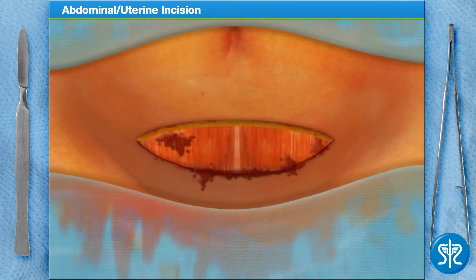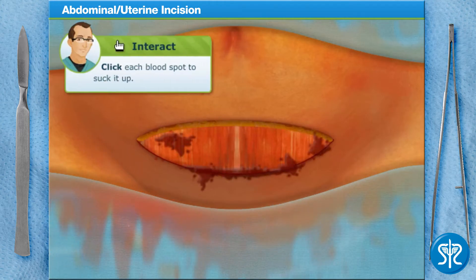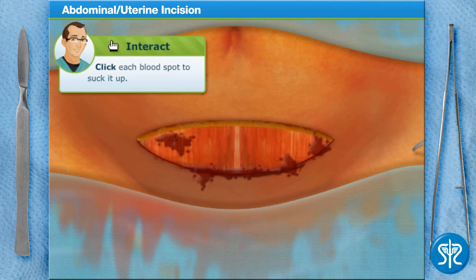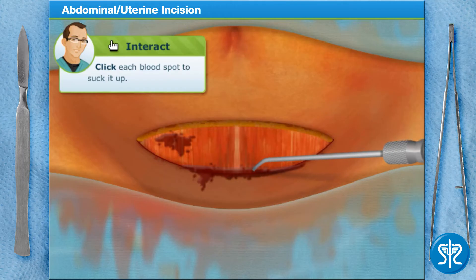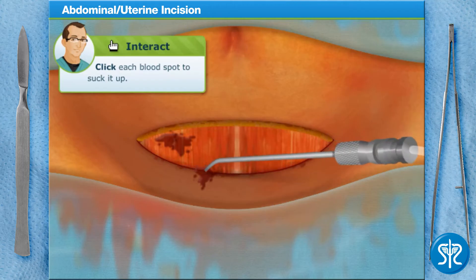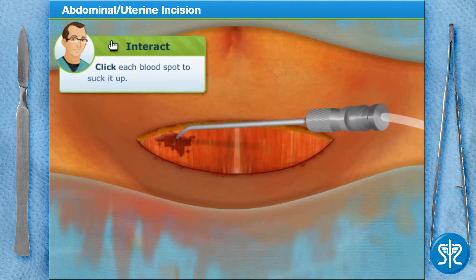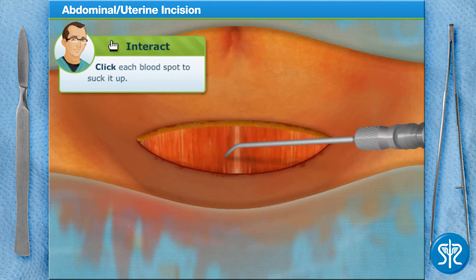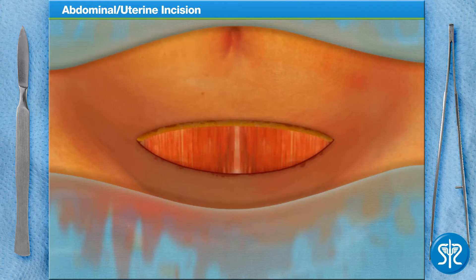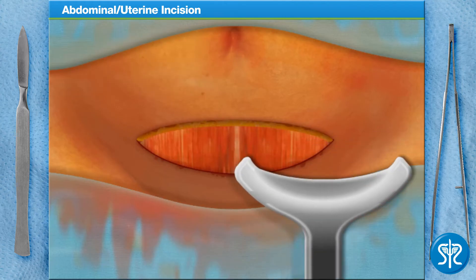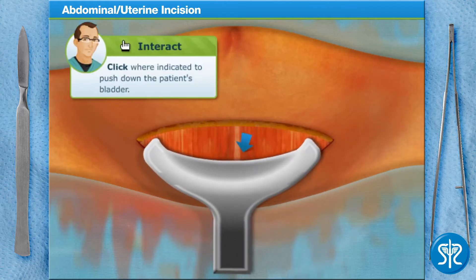It's getting a little messy in there — use the suction to clear out some of the excess blood and fluid. Insert the retractor to push down the patient's bladder.